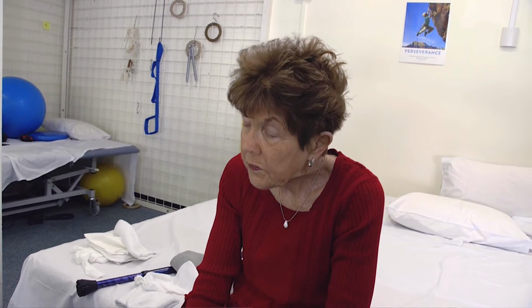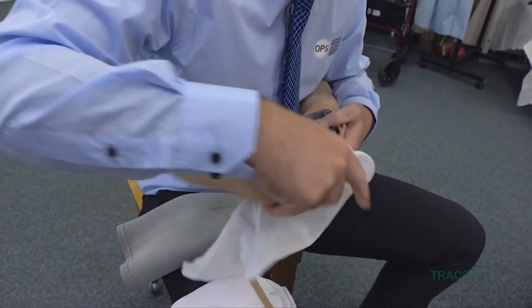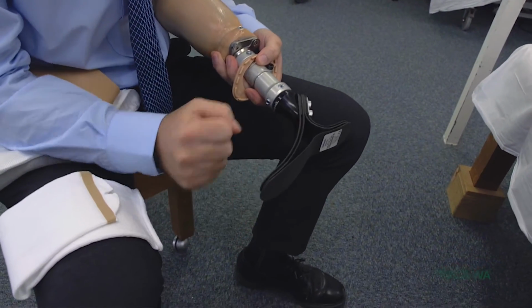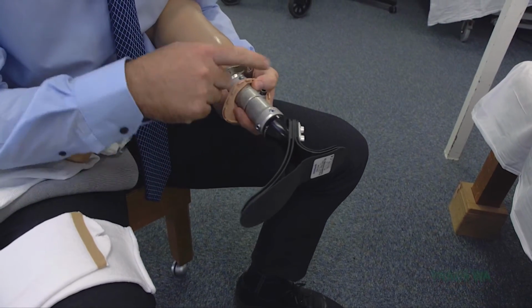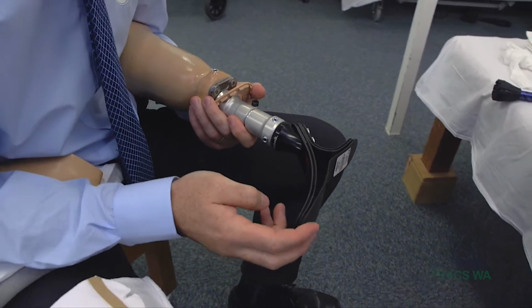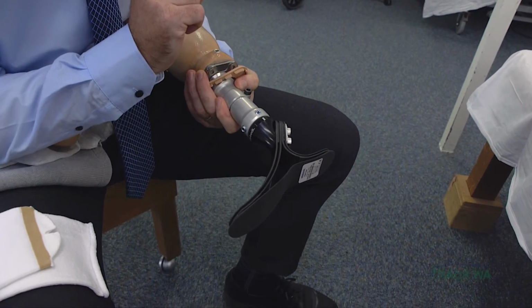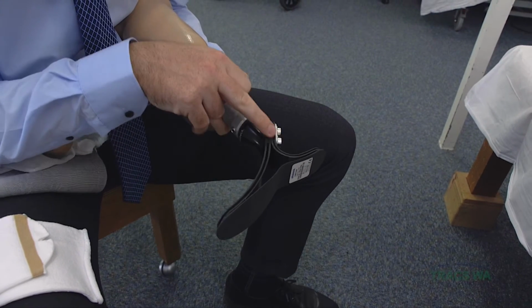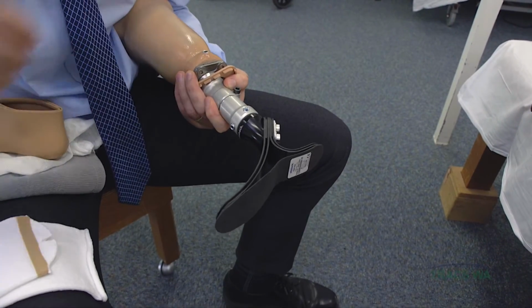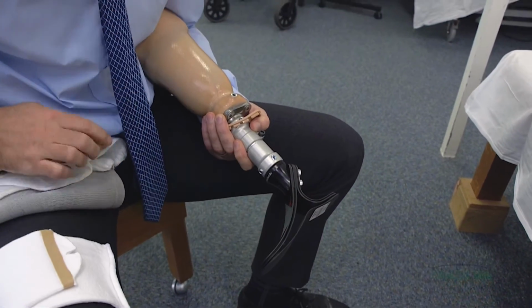The other part of this prosthesis that will be different is that the interim or temporary prosthesis has a solid ankle foot. This is an example of what's called a multi-axial or a dynamic foot that has some movement inside it. You mentioned a long time ago about a running blade, and I said at the time, well, you might get a little one. A dynamic foot may include parts like this, some carbon blades that allow you to have some movement and some spring inside the prosthesis, albeit sitting inside a rubber foot shell so that it looks like a foot and a shoe fits nicely on.